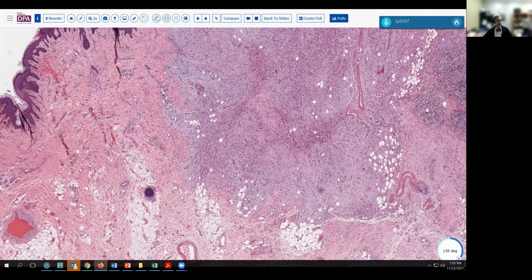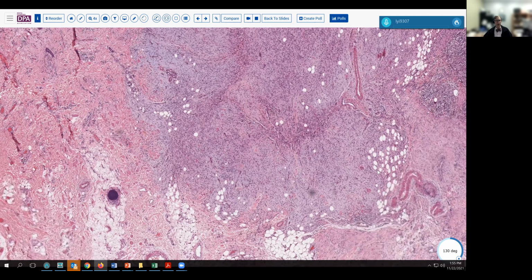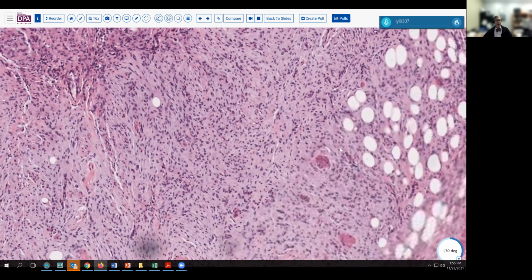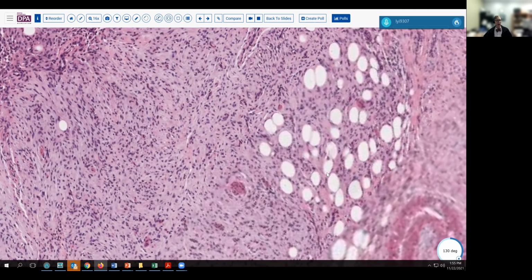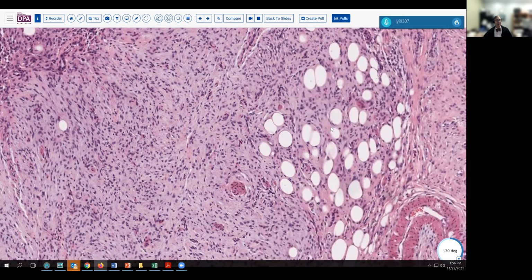And the other feature that I'd call to your attention is this pattern of infiltrating the fat and extending itself around the adipocytes and gradually engulfing and essentially overgrowing them, eliminating them, leaving you with this pattern in transition, but here completely gone, perhaps, of this scaffolding around the fatty tissue.